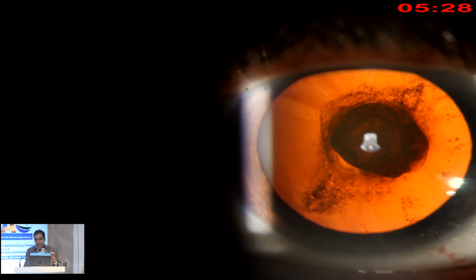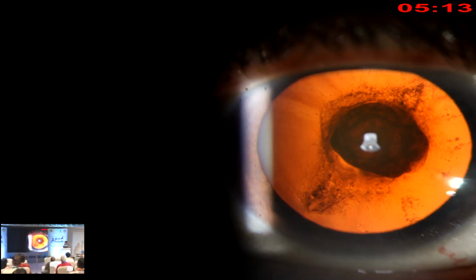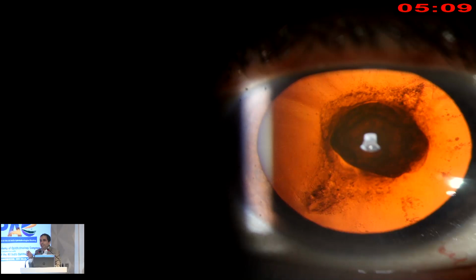Right. But can people who are not very versed with this primary capsular access do it with a vitrector also, if they have access to a vitrector? So vitrectorexis can be done, but it isn't always very predictable. Very often it can split immediately the moment you try and touch one area, and the rexis margin sometimes isn't very strong. So although it appears circular, when you inject the IOL and manipulate it, it tends to split away.